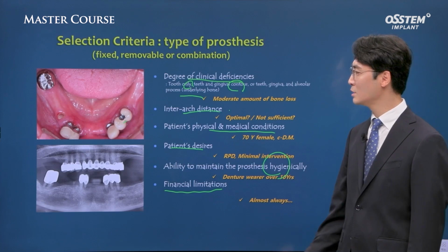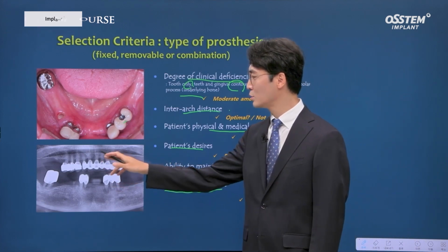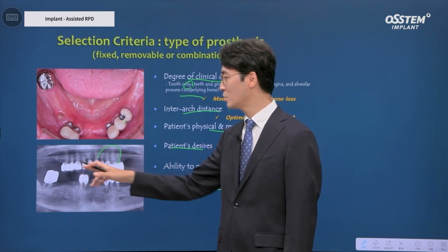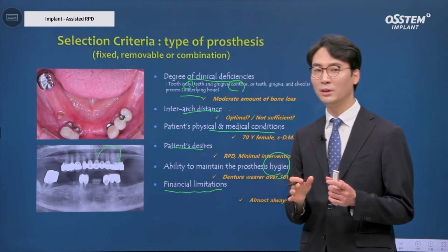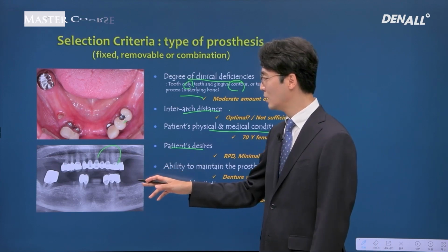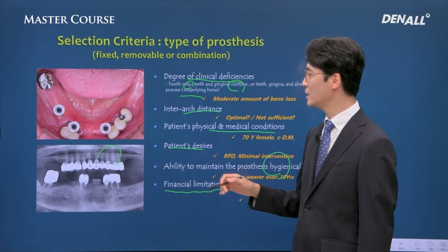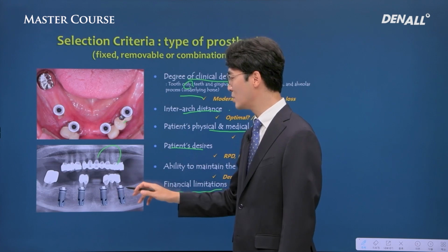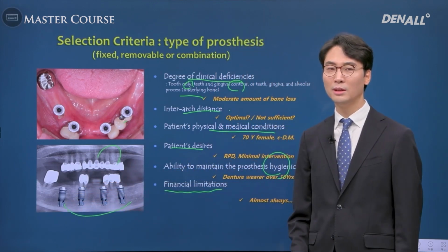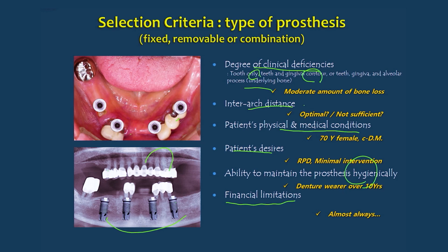In the case of this patient, the patient has been using a removable denture in the upper for 10 years very conveniently, and periodontal treatment was required, but with the periodontal treatment, the patient would be able to use it for long. In the lower, after consultation with the patient, from 5 to 5, 4 implants were to be placed. 10-unit fixed prosthesis was planned, and in the posterior area, Kennedy Class 1 partial denture was planned.